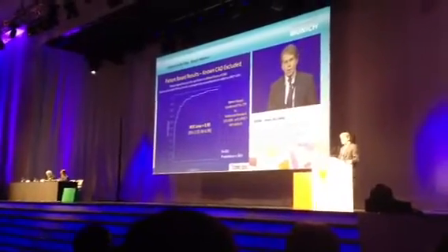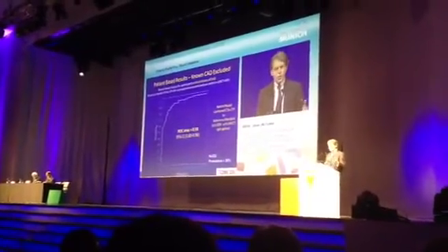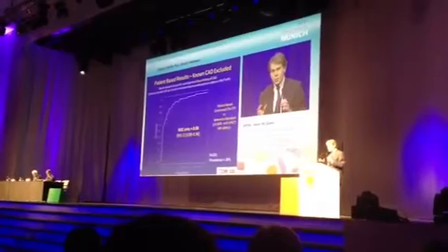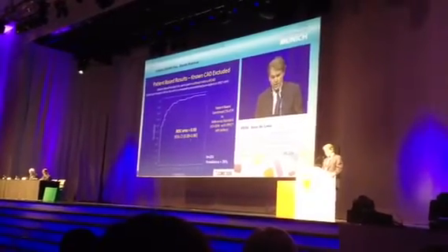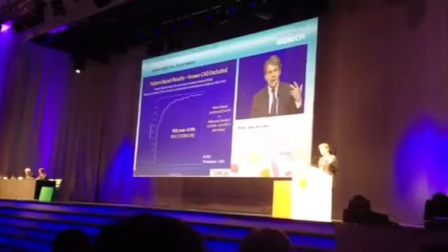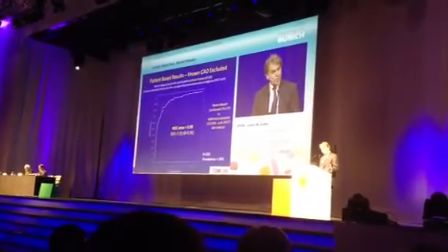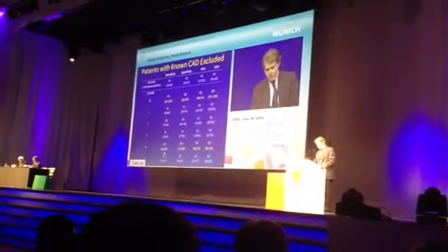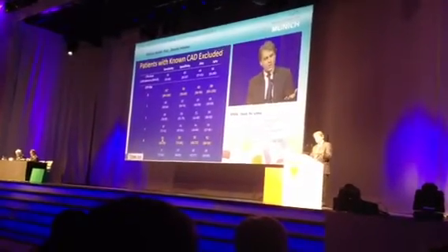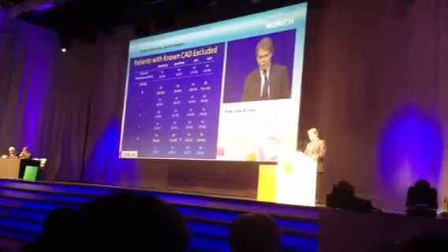Now, what about patients without history of CAD? If you take only the group of patients without known CAD, then the area under the curve is 0.93. So it's an extremely powerful test. And now, if you use a similar table, sensitivity and specificity is 80%.